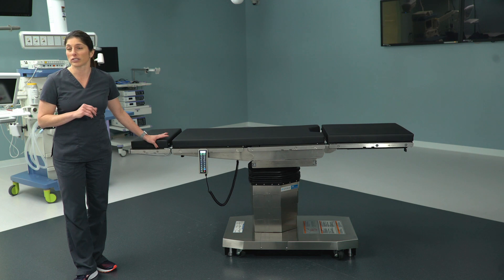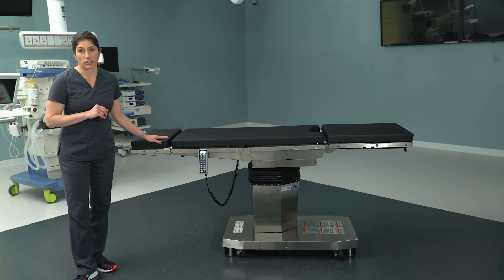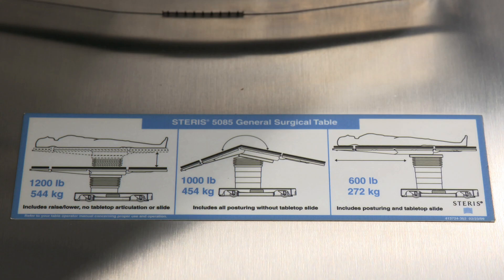Know that the battery life is good for two weeks — so with Monday through Friday, full-day use, you'll have a solid two weeks of battery life on these tables. Another thing you'll notice at the base at the head end of the bed is the label with the weight capacity information, which is actually pretty similar to the 3085. There are three numbers to be aware of.